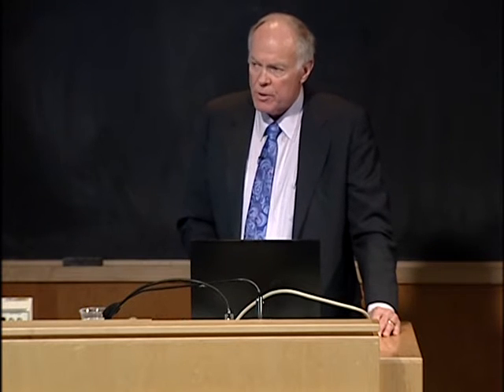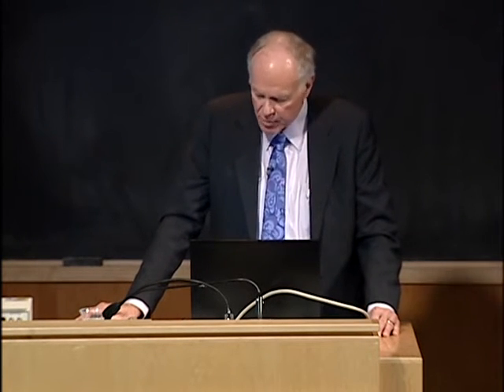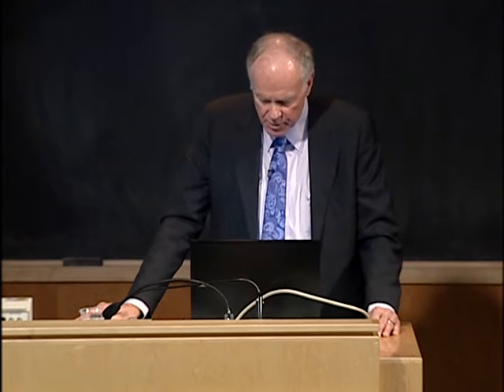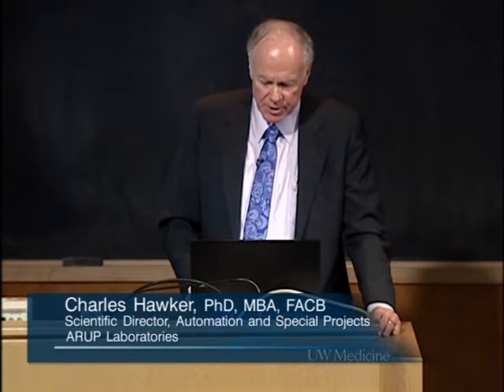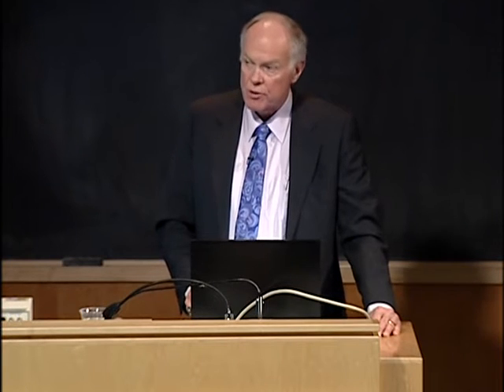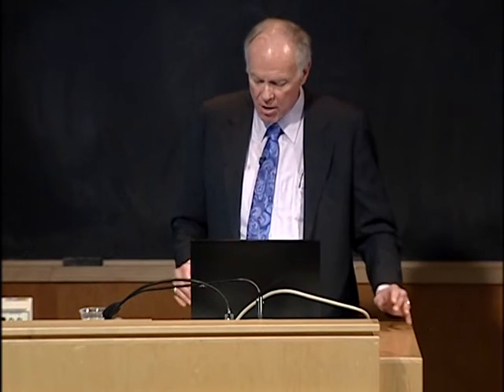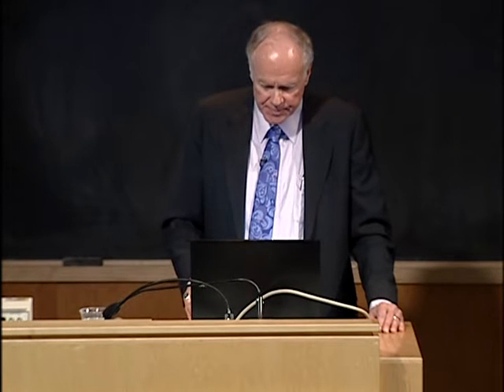We did this extensively in 1996 before implementing our current automation, which went live in 1998. We've been doing it for the past year as we get ready for our new automation. And we have not even attempted to send out RFPs for vendors and designing systems and even choosing the track until we had done all of this mapping, which was done a little over a year ago.